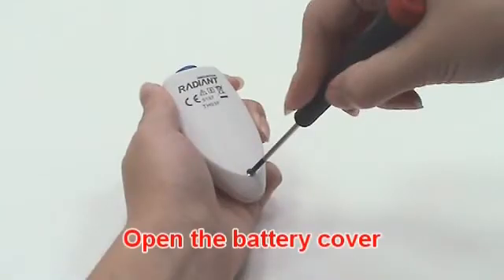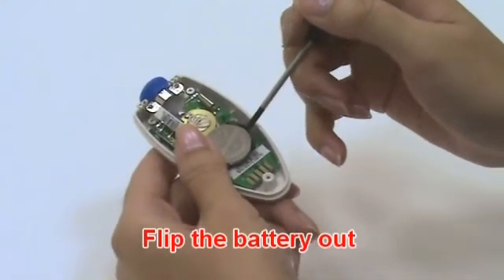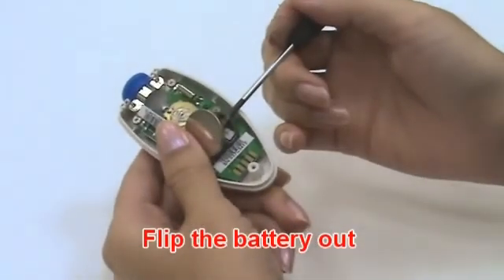When the low battery icon appears, please change the battery. Use a screwdriver to open the back housing, then hold the device and flip the battery out with a small screwdriver.